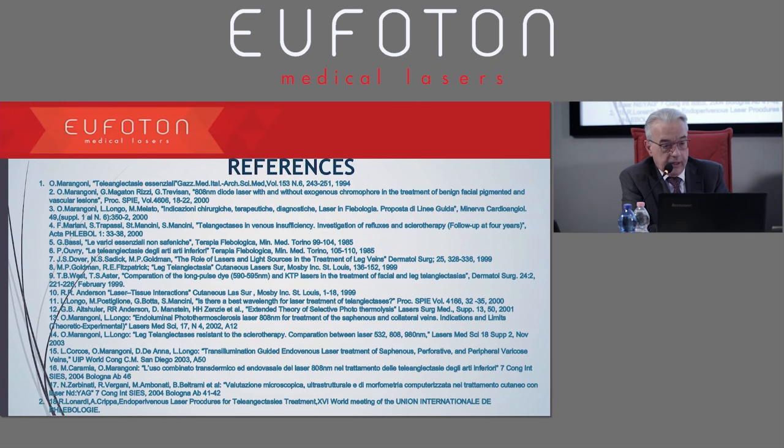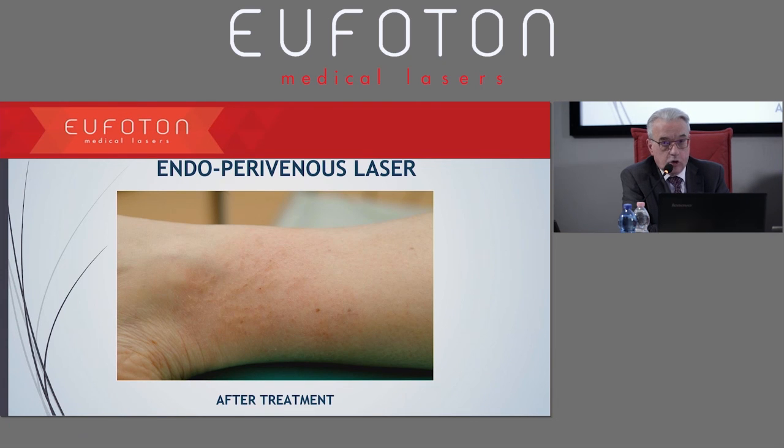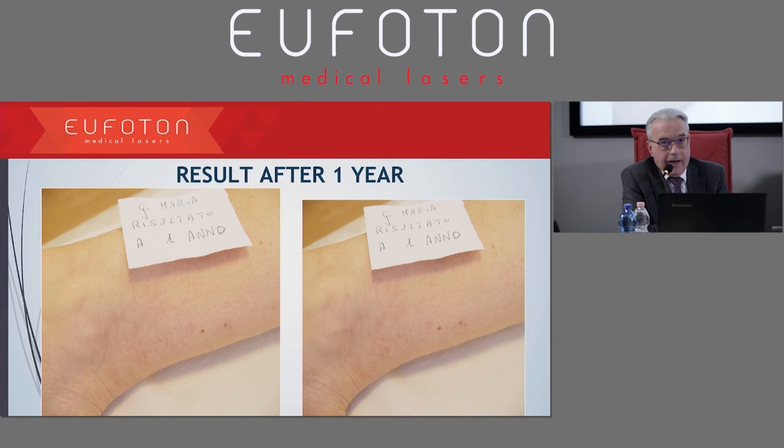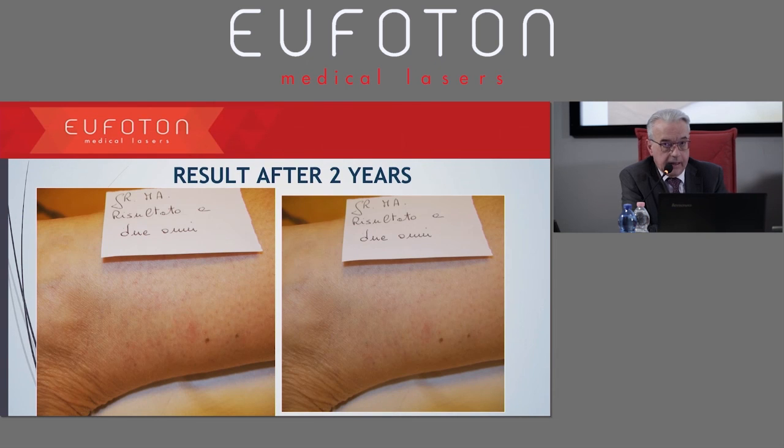Here is my literature reference. Endo-Perivenous laser on the ankle for small telangiectasias right away after the treatment. 1 month after the treatment, you can still see some reddish areas. After a year, the patient came back for a full follow-up.